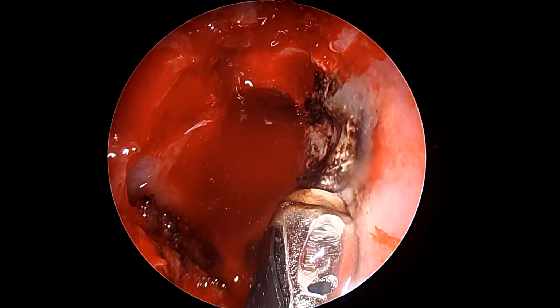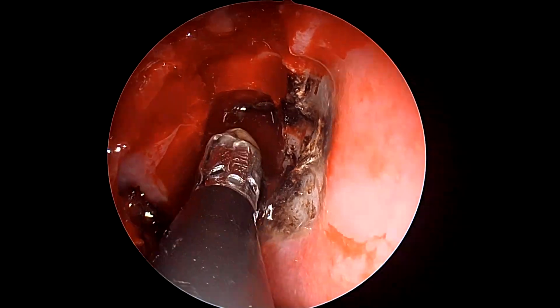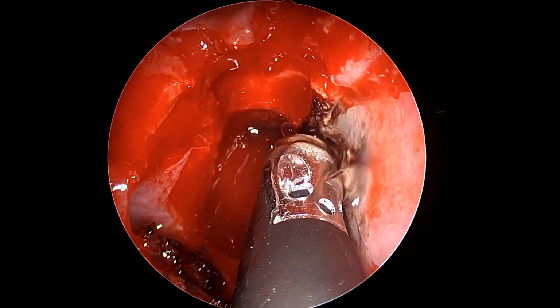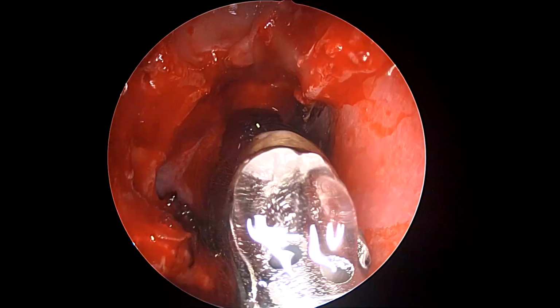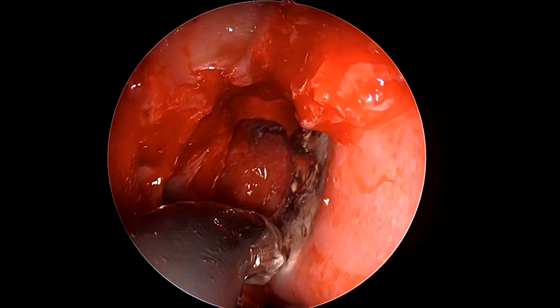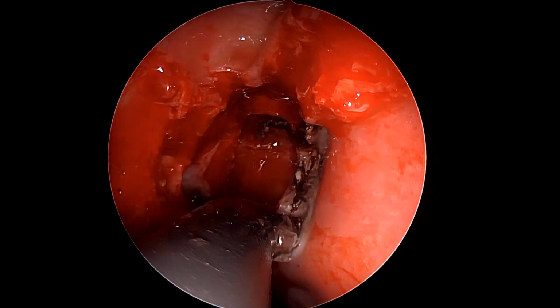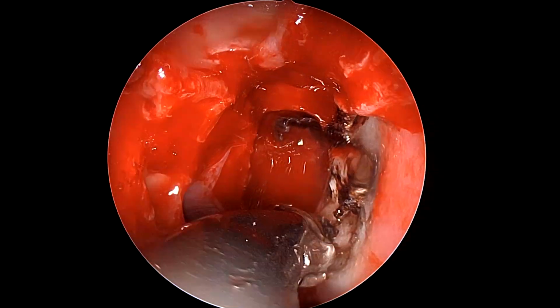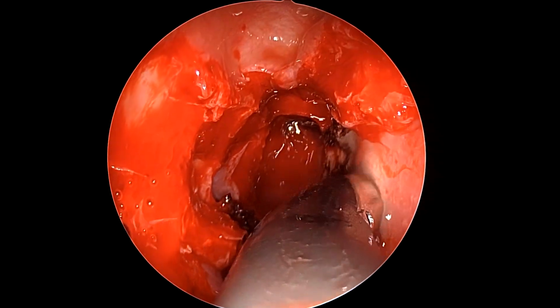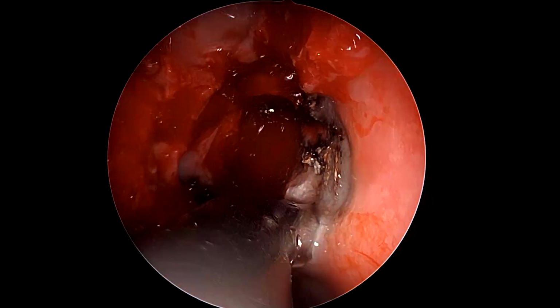Once a reasonable amount of sphenotomy has been completed, now we are ablating, using a coagulation wand, the posterior part of the septal mucosa on this side, progressively one by one, initially a little bit and then probably more as we go forward, because this part of the septum will go. But mind you, we said that we'll do a 1.5 nostril approach in this patient, so we will only ablate the septal mucosa on that side and we will remove the bone on this side, but we do not want to ablate the mucosa on the other side.